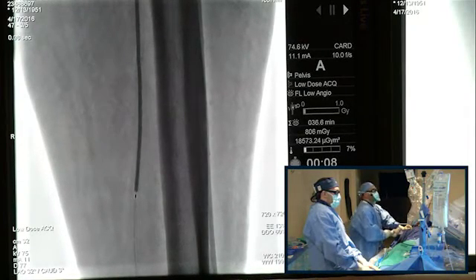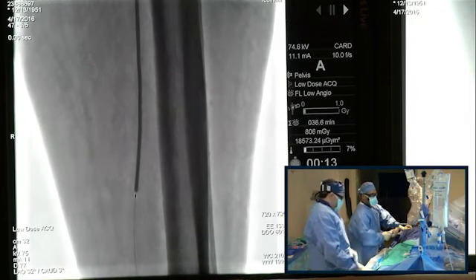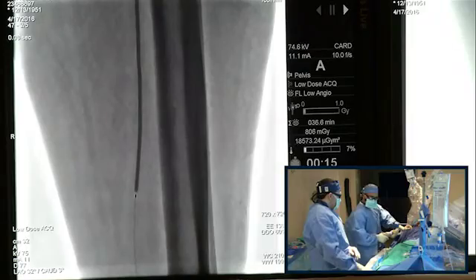Our experience for below the knee stents is limited to the peroneal trunk area, probably because we try to avoid any bifurcation with the posterior and peroneal. And when we have focal, severely calcified lesions that would need some scaffold, but I really don't believe in below the knee stenting, actually.